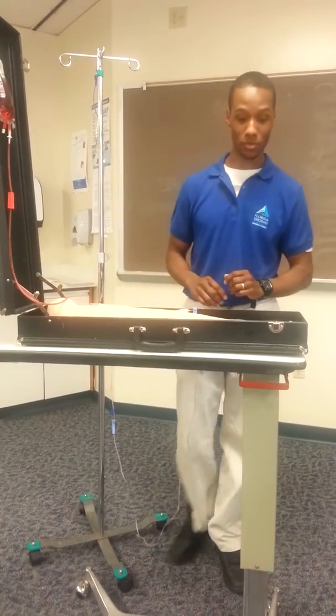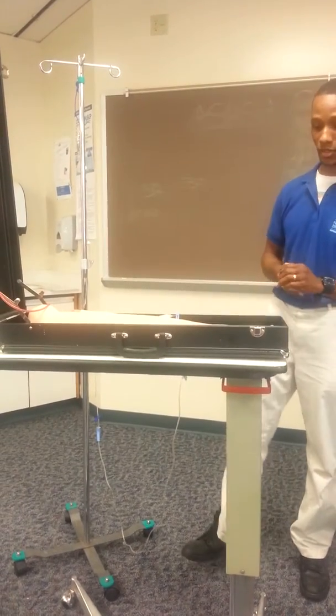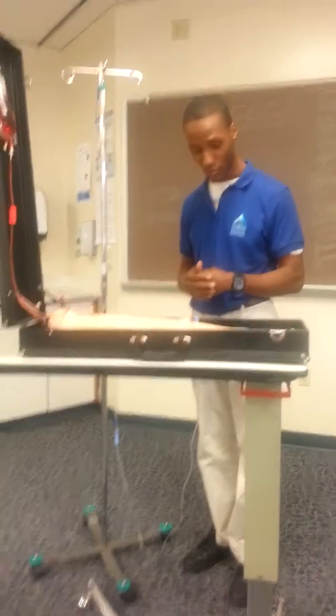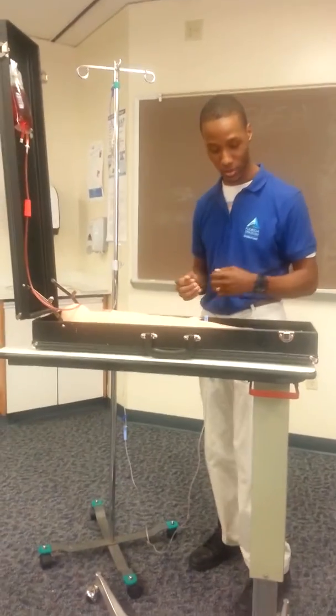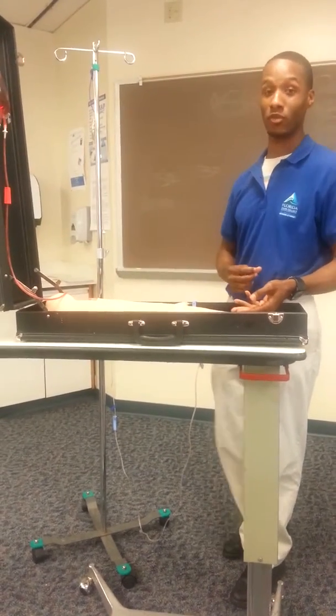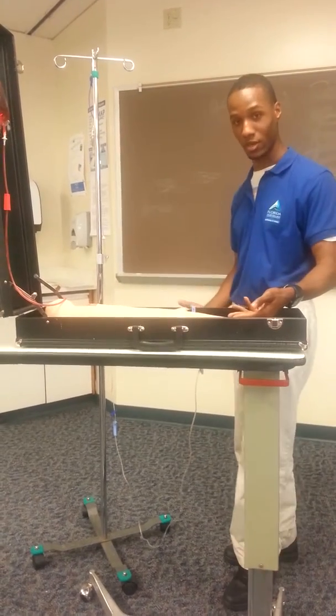I will go into my patient's room. I'll introduce myself. Hello, Mr. Johnson. My name is Samuel. I'll ask Mr. Johnson to identify himself. I will match that with the patient's name and date of birth on the patient's armband. He's verified that, both name and date of birth.